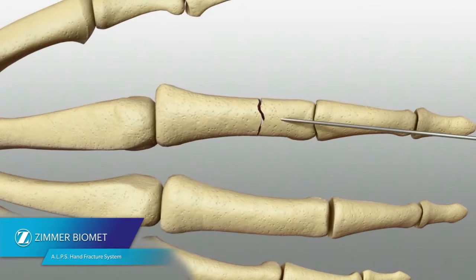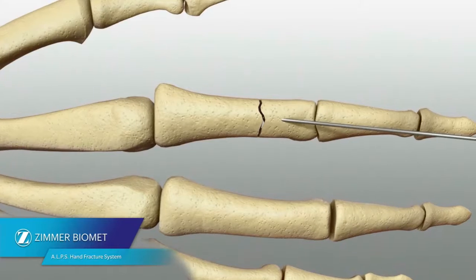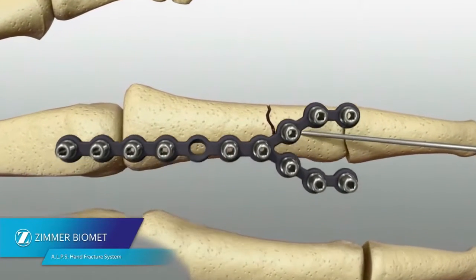Achieve provisional stabilization of the fracture using towel or reduction clamps or K-wires. Determine the appropriate plate shape and length. Plates can be trimmed and shortened to more closely match the anatomy and fracture geometry.